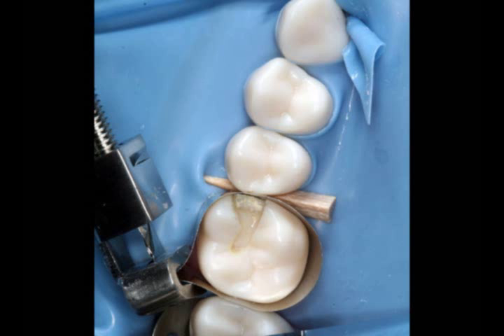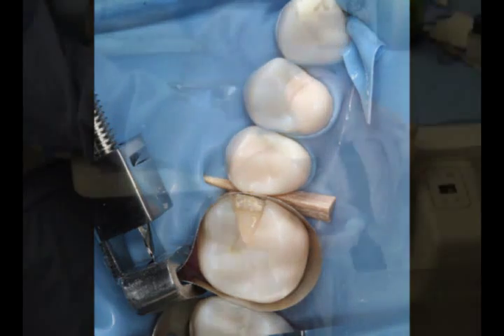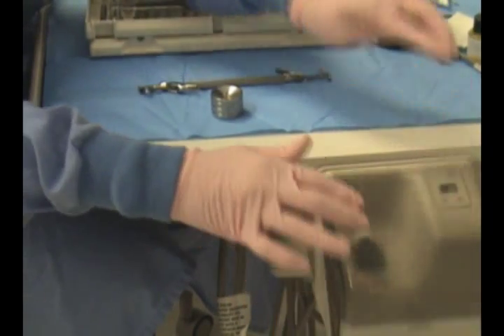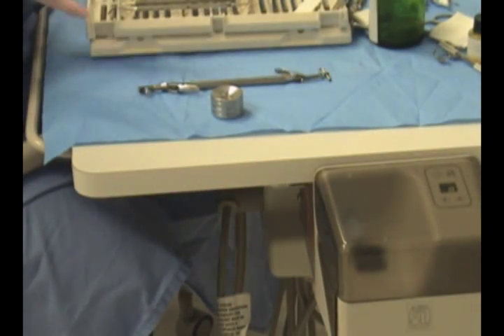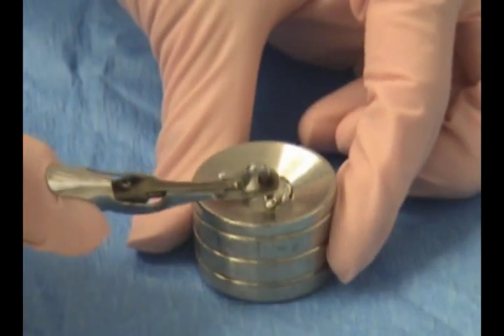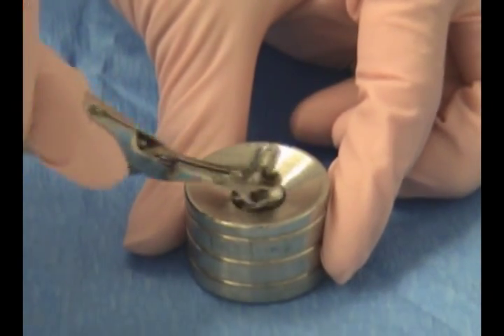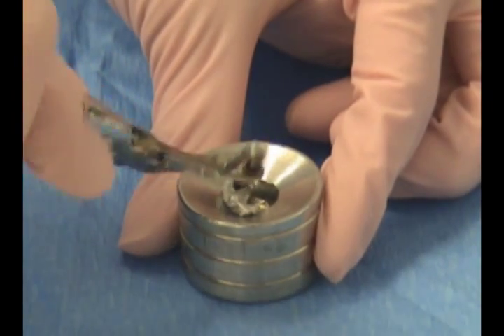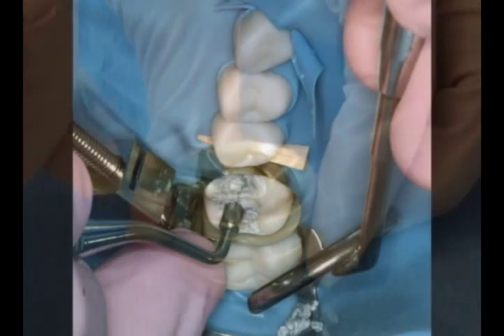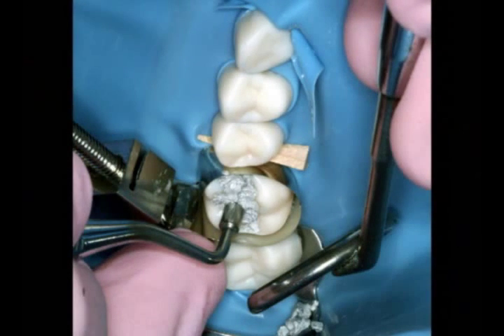With the matrix band and wedge in place, we are now ready to restore the tooth with amalgam. An amalgam capsule is now placed in the amalgamator. The amalgam will be triturated for the proper amount of time. Once it is triturated, the amalgam will be placed into an amalgam well. The amalgam is now placed into the carrier. Make sure you fill the carrier thoroughly before handing it to the operator. The amalgam will be packed into the preparation by using an instrument called a condenser.